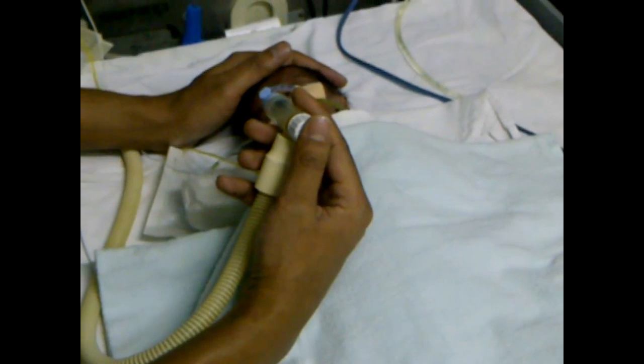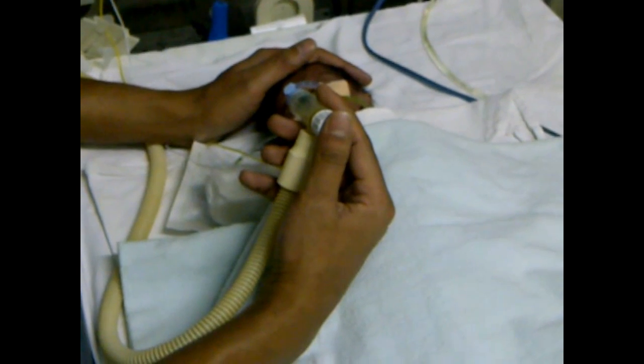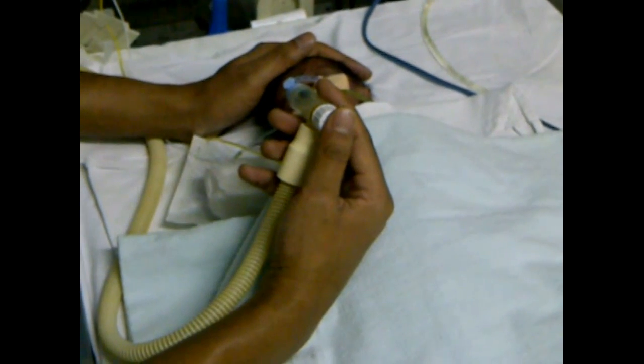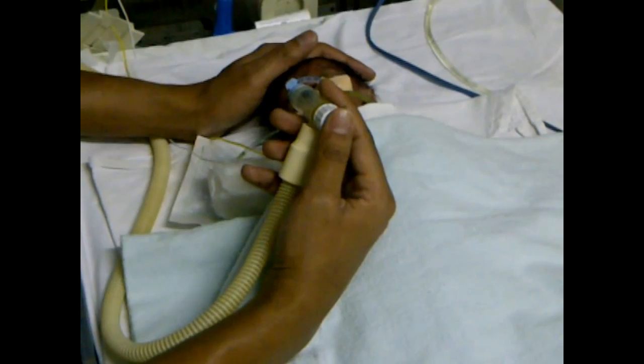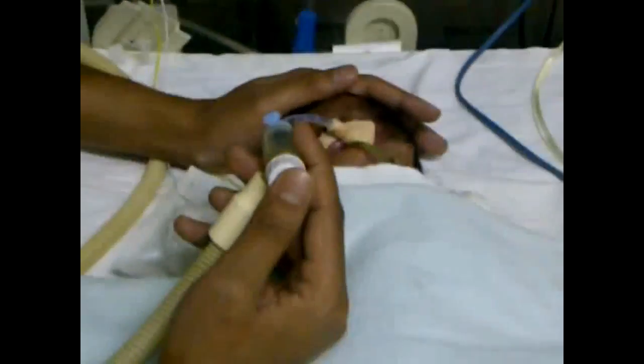There is no exhaustion for the caregiver unlike an Ambu bag, and we also deliver controlled breaths to our patients in a consistent manner. So this is how we do it.